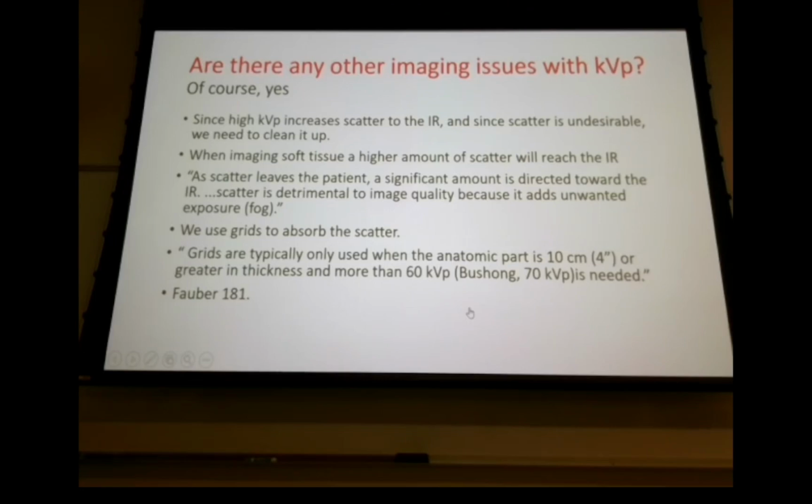So you up your collimation and lower your Compton. Exactly. Expose less tissue, increase collimation. There's an inverse relationship. You increase collimation, you decrease field size, right?